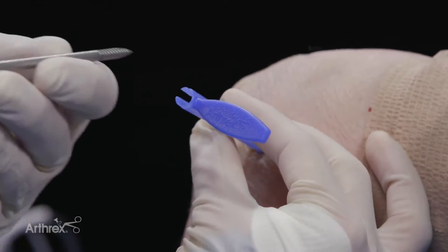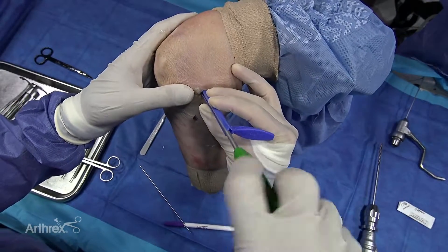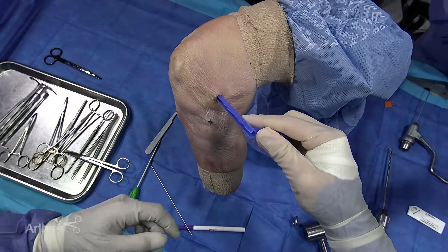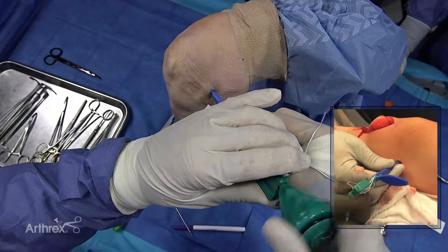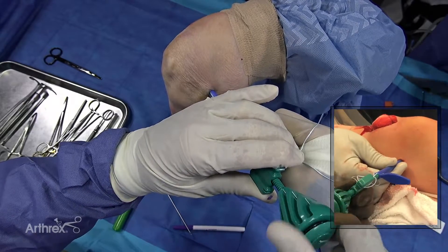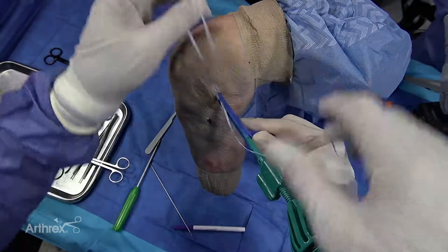Your assistant holds this in place, and now we're going to tap it right down the same hole. Now I need my swivel lock. You use the swivel lock and push it in, engage the swivel lock, so it's completely seated. Typically you can feel it with your finger — you can feel when it's completely seated — and then when it's done, you remove it.